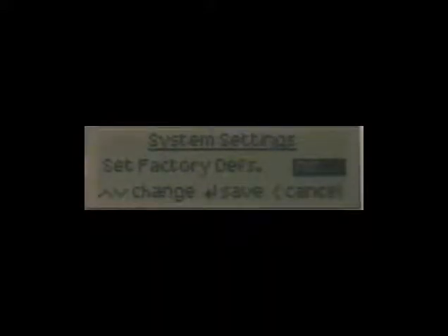The Sensormate 2 is provided with a default configuration preloaded onto the unit. If the unit is a refurbished unit, it is advisable to restore the default settings. To restore the default settings, scroll to the system settings menu and set factory defaults to yes. Enter this and the unit will reload the default values.